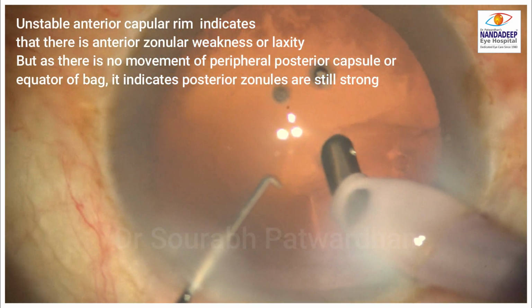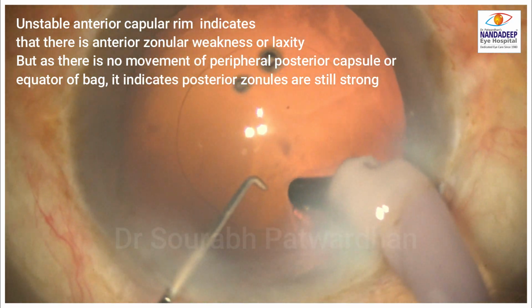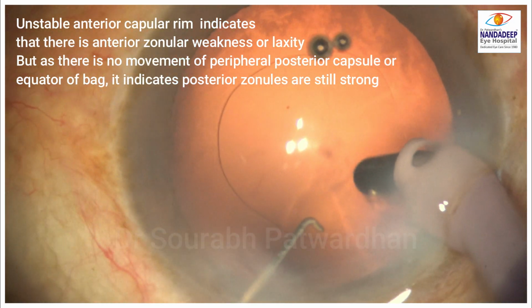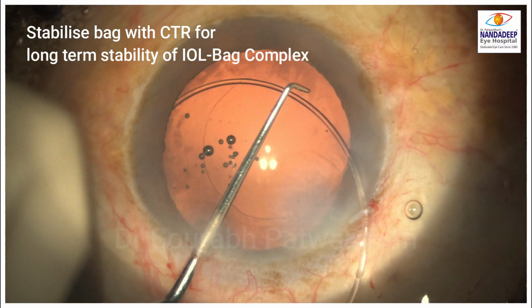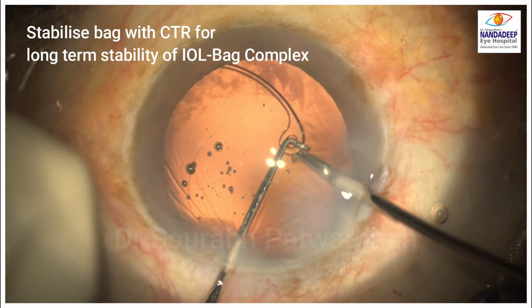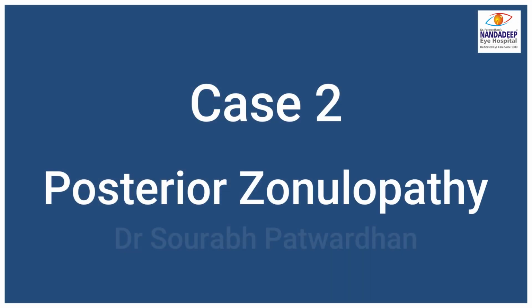In this case, the unstable anterior capsular rim indicates that there is laxity of the anterior zonular complex, but as there is no movement of the peripheral posterior capsule or equator of the bag, it indicates that the posterior zonules are still strong and giving good counter traction during the cortex aspiration. It is best to stabilize such a bag with a capsular tension ring for the long-term stability of the IOL bag complex. After seeing this case, we'll compare it with another case, which is a case of posterior zonulopathy.